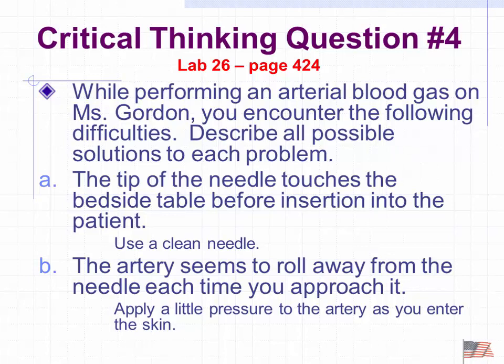Little rascal. Different people have different techniques for how they palpate and pin down the artery. The technique I use is a two-finger method. So if this is my artery, I place a finger on either side of it and I kind of manipulate it. Some people will use one finger. There's a whole bunch of different techniques that you'll end up finding. Whatever works for you. I don't care. And you'll get a feel for it.